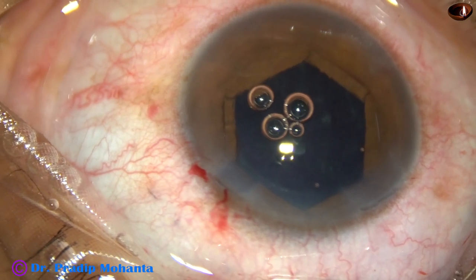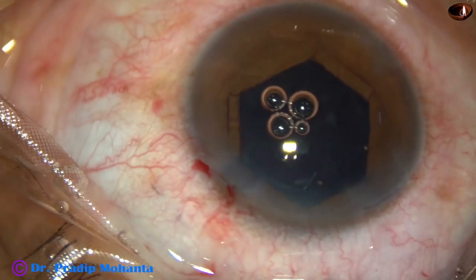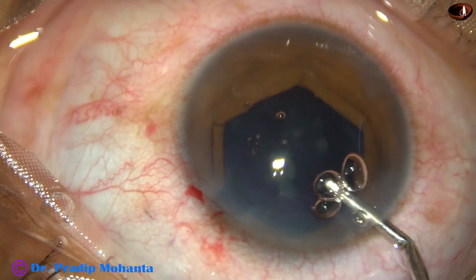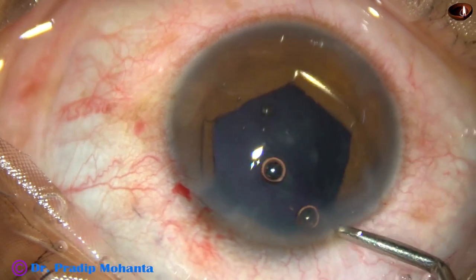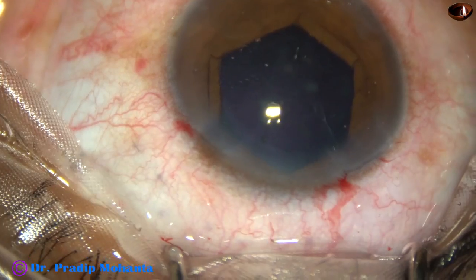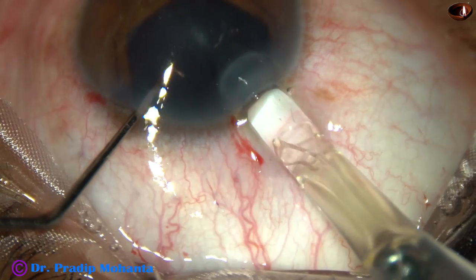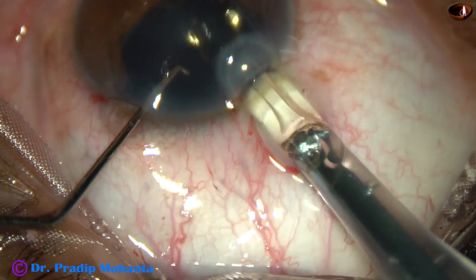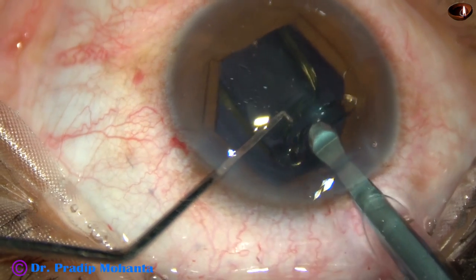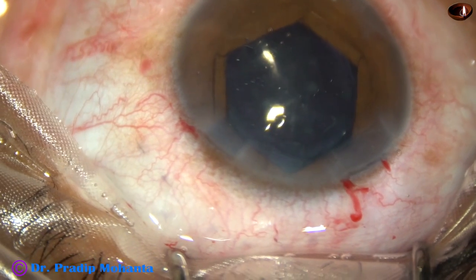Most likely, when I injected trypan blue dye underneath the iris, some dye went through the zonule into the vitreous — and that's why I don't get any red glow. We did ultrasonography B-scan in this case and there is no echogenic reflex in the vitreous; the retina is attached all around.